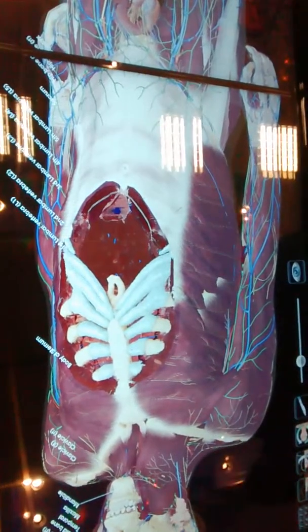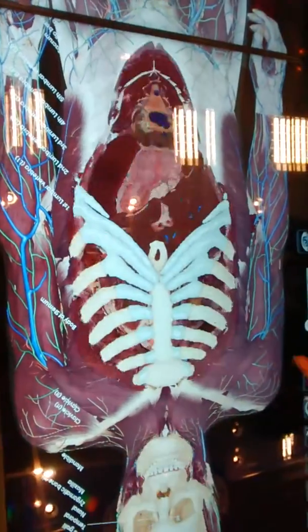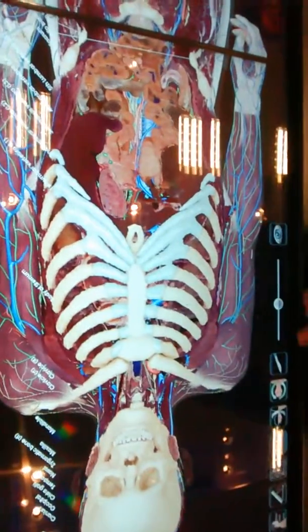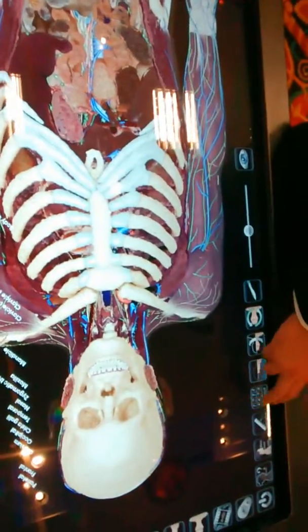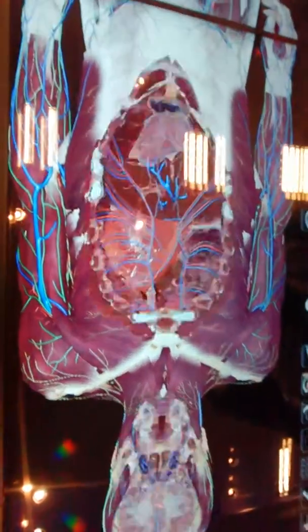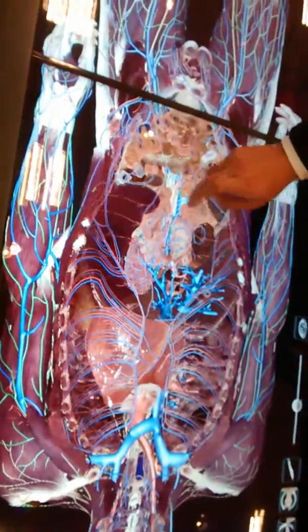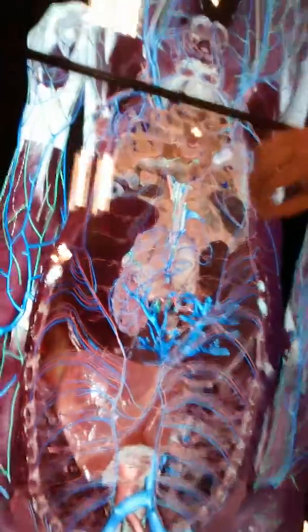It's very hard to see, that kind of thing, but everything else here you can see. Let's say if we want to go and isolate the cardiovascular system, we can do that as well. So you can see inside here it is actually real patient data.